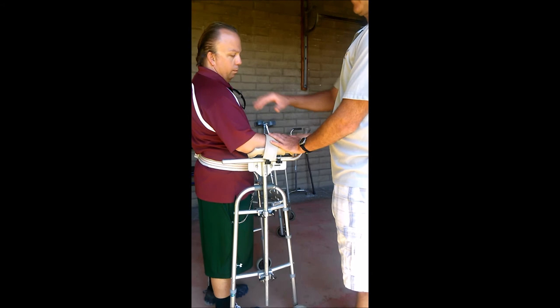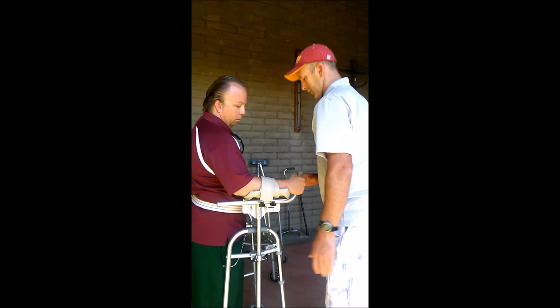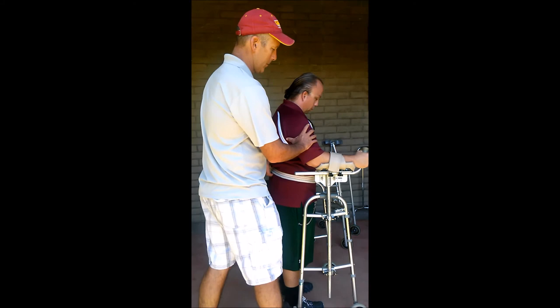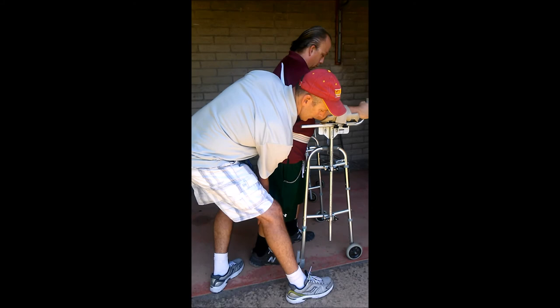John has just recently had a stroke and has a paralyzed right upper extremity, but he has a little ability to depress the shoulder and push down through the elbow - and that little bit makes a huge difference for him being able to walk. I'm going to be on the weaker side, possibly working with another therapist or aide, stabilizing alongside. Let's move the walker forward - left foot - and a little bit of help here.